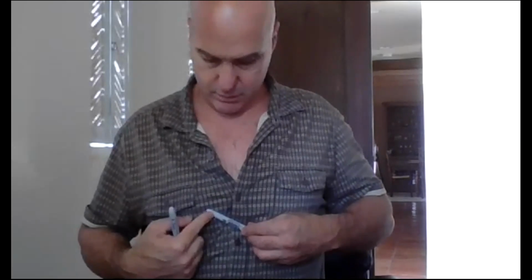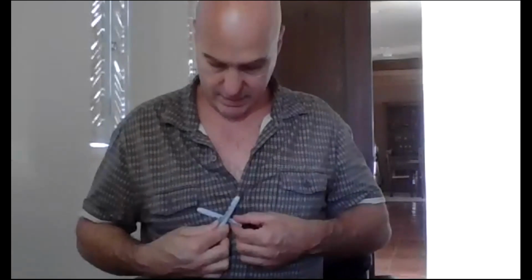They come together to form the portal vein, which continues on as right, and then the left portal vein comes off at quite an angle, but that is where the edge of my liver is. Does that make sense? Everything's backwards on this.